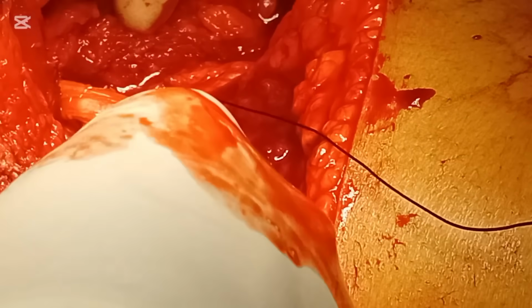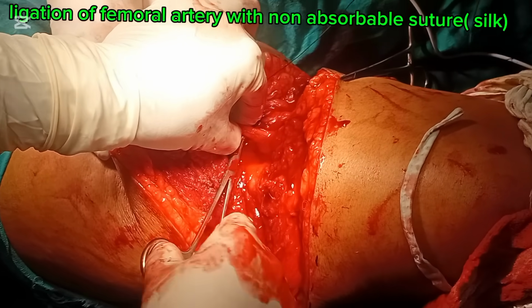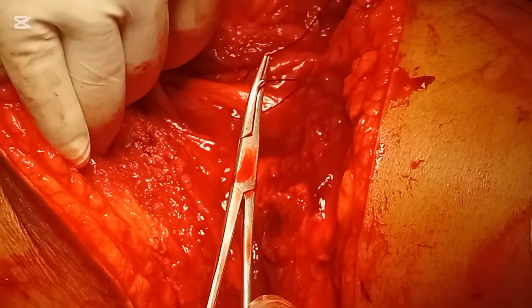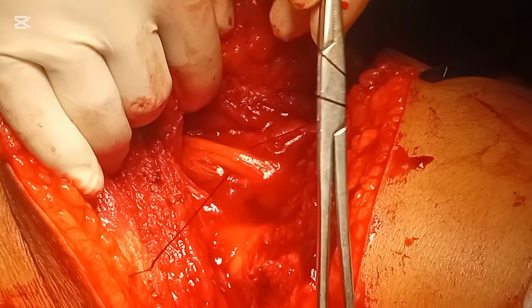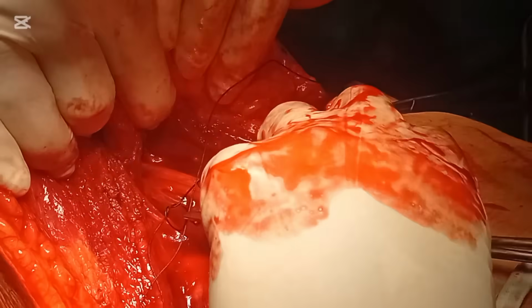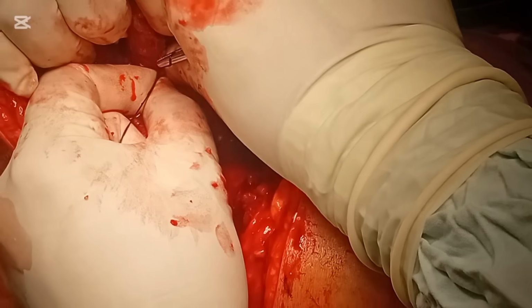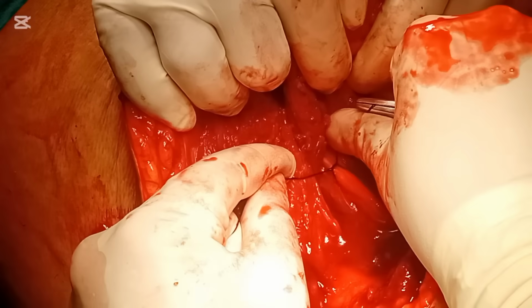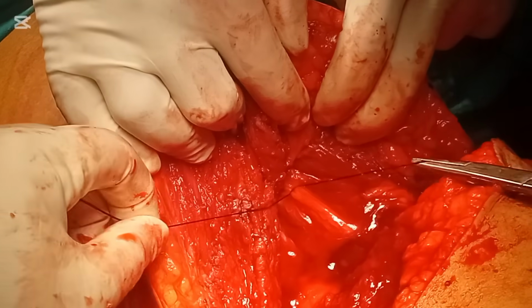The artery is palpated and it is being ligated with a non-absorbable suture. We used silk. It is necessary to use a non-absorbable suture to prevent any future complications of leakage and also slipping of the suture, as it will lead to secondary hemorrhage, which is most of the time considered life threatening because it is a large artery of the body. So it will flush the whole of the blood from your body outside.